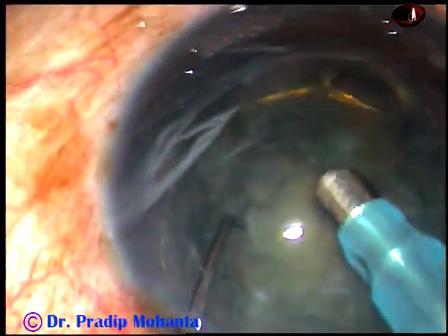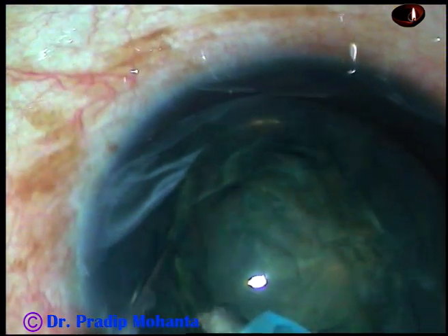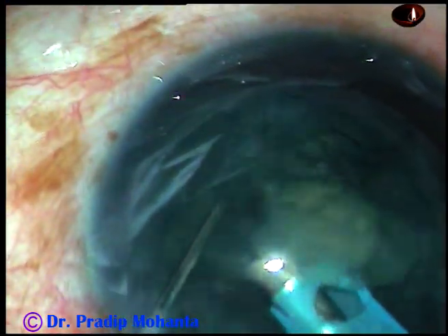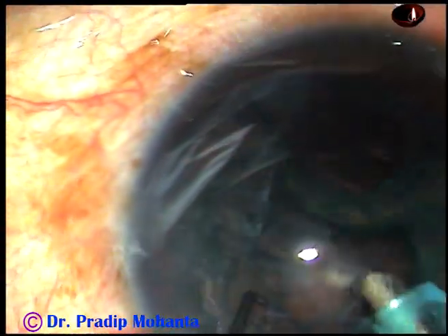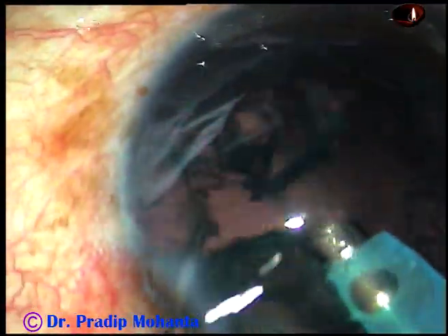The nucleus has been nicely rotated. This is a prerequisite for the carousel technique. Now place the tip at the edge of the nucleus. Use vacuum — the nucleus rotates like a carousel and it gets removed in no time. Now the epinuclear shell is removed.